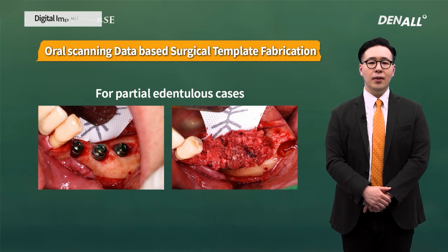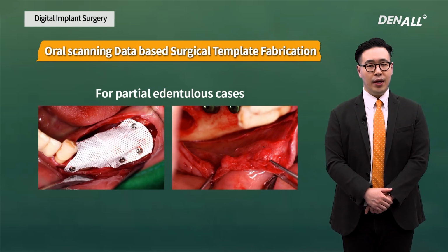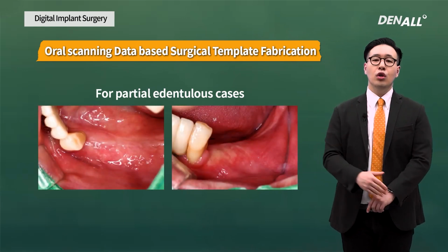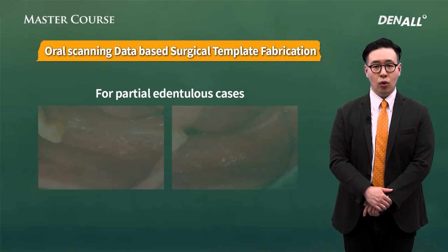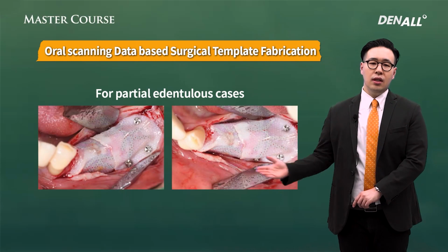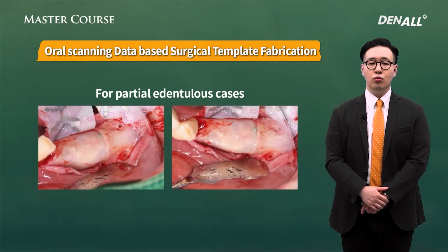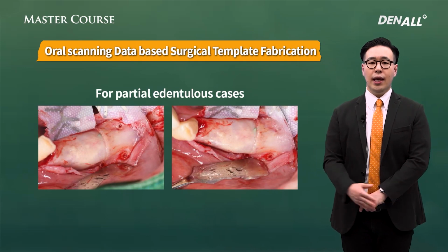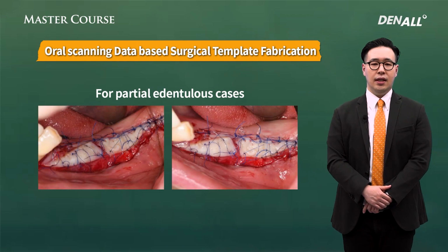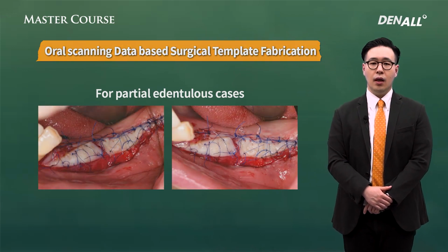Autogenous bone is combined in the graft material, and the titanium-reinforced DPTFE membrane is fixed. The flap is released, and the first suture is done. After 6 months, it looks like this. After the flap is raised, the titanium DPTFE membrane is exposed and removed, and you can see thickly ossified regenerated bone, which is verified before performing FGG. The second surgery is also planned.